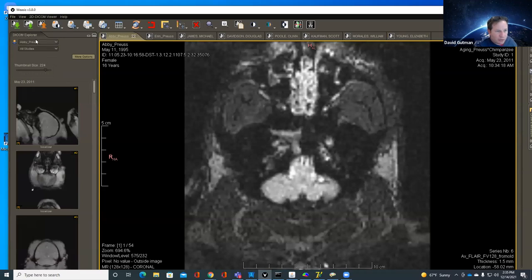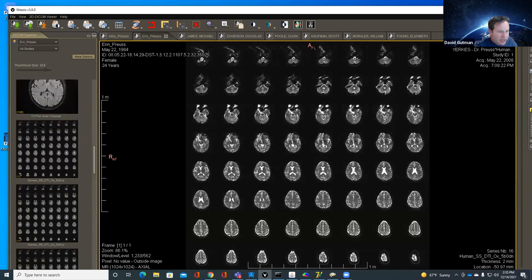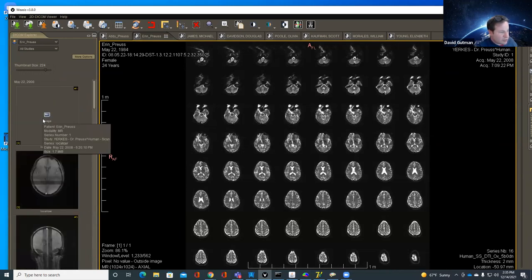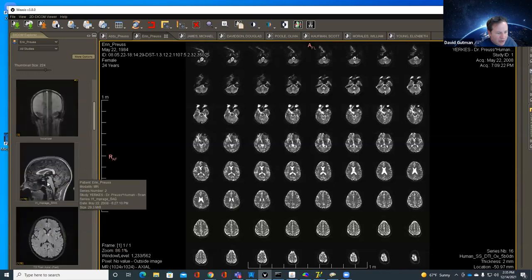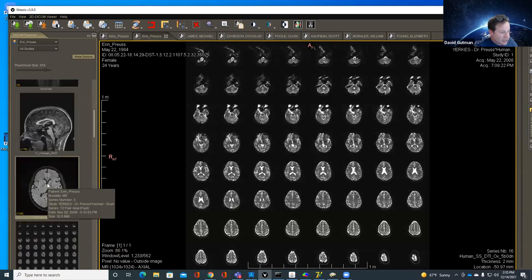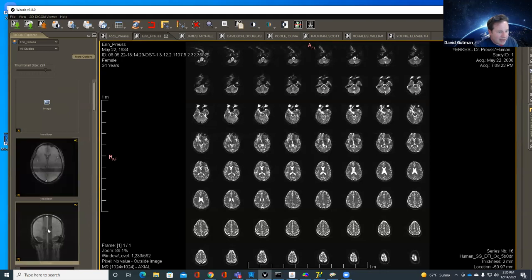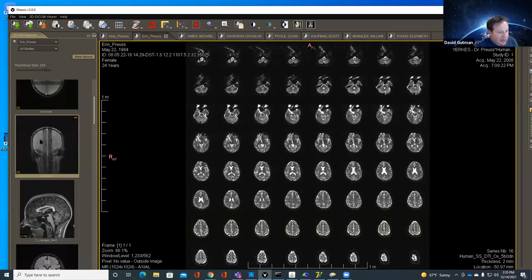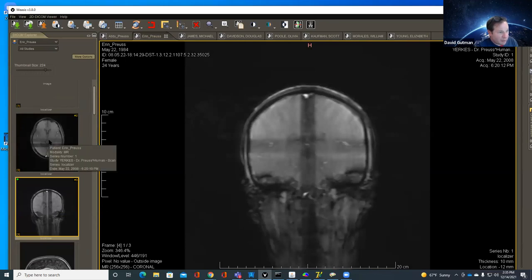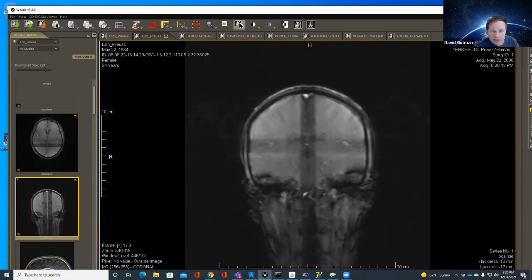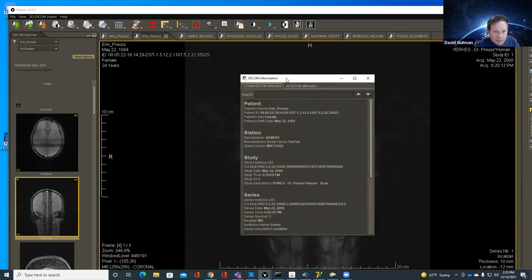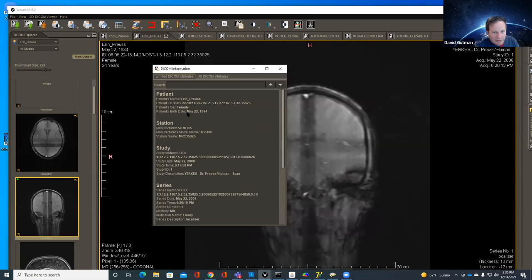Now switching to a different image — this is a DTI series with a T1, a localizer, T1 MP-RAGE, and some T2 data. One question is: do I just want to release everything in here? Technically I'd have to go through the metadata in every one of these different scans. I click to look at limited DICOM attributes and immediately find: patient birth date — no doubt that's a bad thing to have.